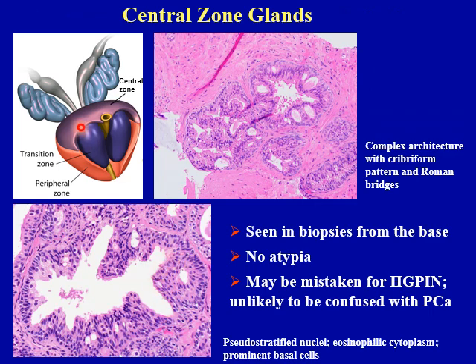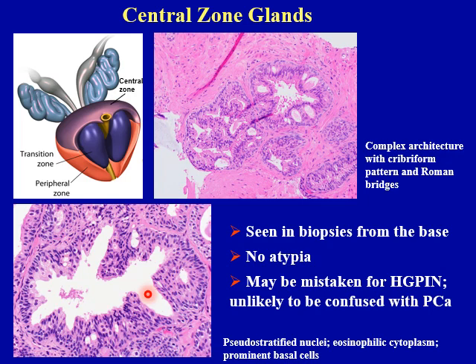Central zone forms the base of the prostate gland. Therefore, central zone glands are seen in biopsies taken from the base of the prostate. At low power, you can see central zone glands have complex architectural width with cribriform pattern and Roman bridges. At high power, you can see these glands are composed of pseudostratified nuclei with eosinophilic cytoplasm and very prominent basal cells around these glands. However, you should not see nuclear atypia in these glands. Central zone glands may be mistaken for high-grade PIN, but they are unlikely to be confused with prostate cancer.